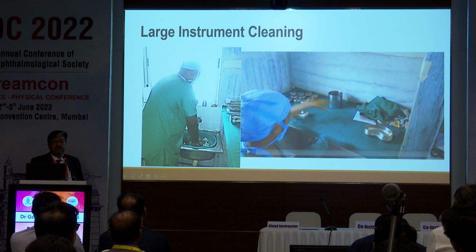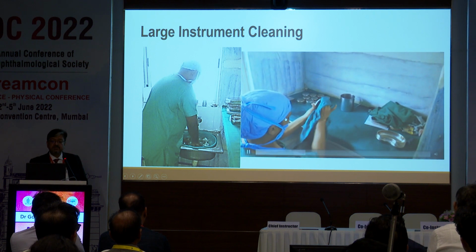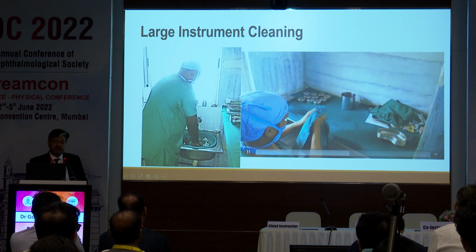Large instruments may not fit into the ultrasonic cleaner, so where you have large volume surgeries, you can just do it in a bucket. They can be done in one go and wiped clean with a cloth.